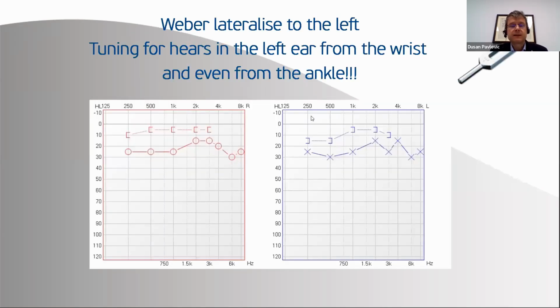And here's his hearing audiogram, which looks pretty much normal, some kind of a mild hearing loss bilaterally. So his complaints are about the left ear, but if we compare left hearing with the right hearing, there is not much difference. It looks pretty much the same.